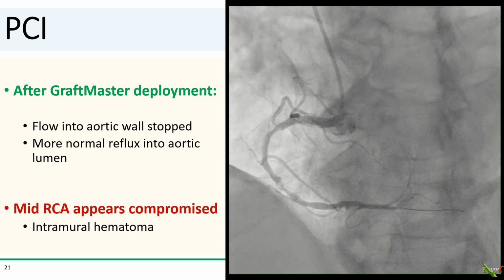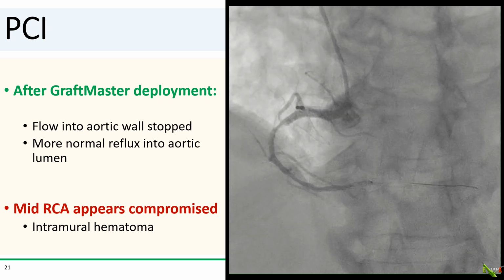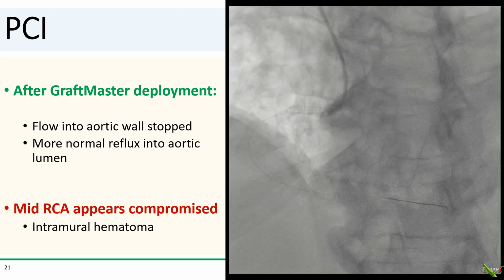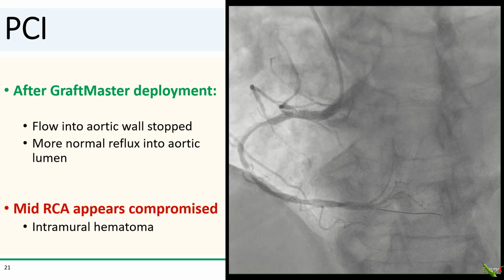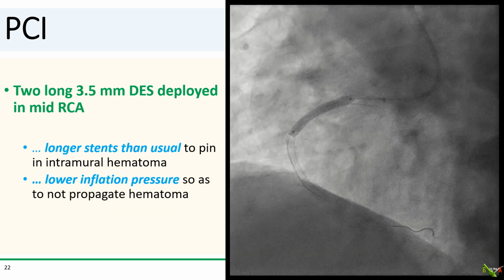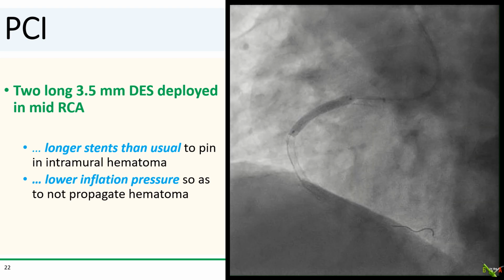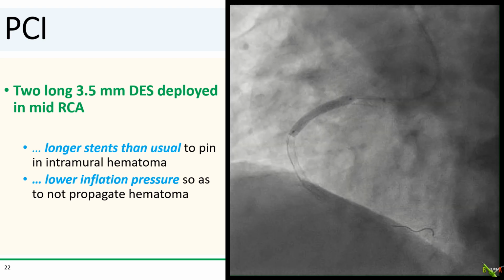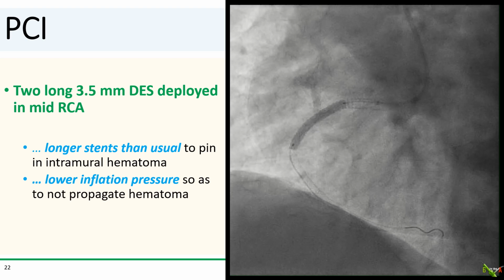And after deploying the Graftmaster, flow into the aortic wall finally stopped, and there is now a more normal contrast reflux into the lumen of the aorta. Unfortunately, the mid and distal RCA now do appear compromised, most probably from the propagating intramural hematoma that's coming from the dissection more proximally. So we went ahead and placed two long stents in the mid RCA, and notice that we intentionally chose longer stents than usual to pin in the intramural hematoma. We also used relatively lower inflation pressures so as not to further propagate the hematoma.